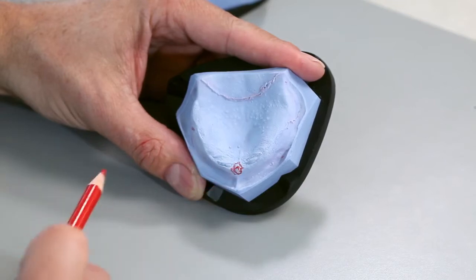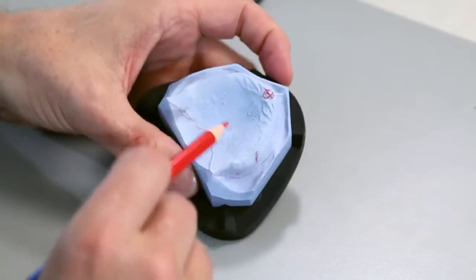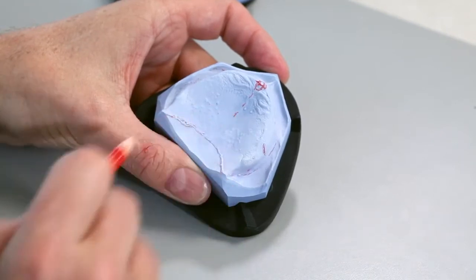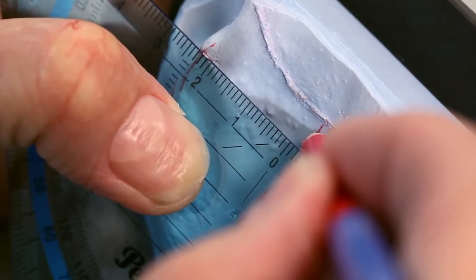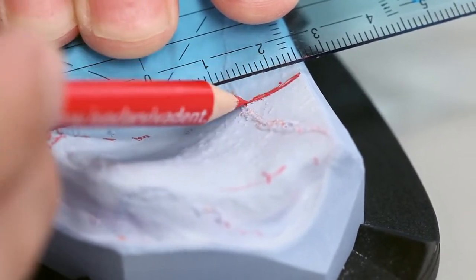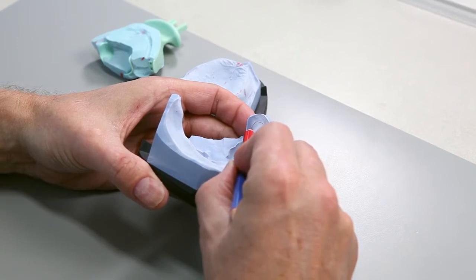The following anatomical reference points are the basis for further working steps: papilla incisiva and the palatine raphe, which forms the anatomical midline. Extend the palatine raphe up to the dorsal area and transfer it to the model edge. Mark the dorsal end of the retromolar pad.